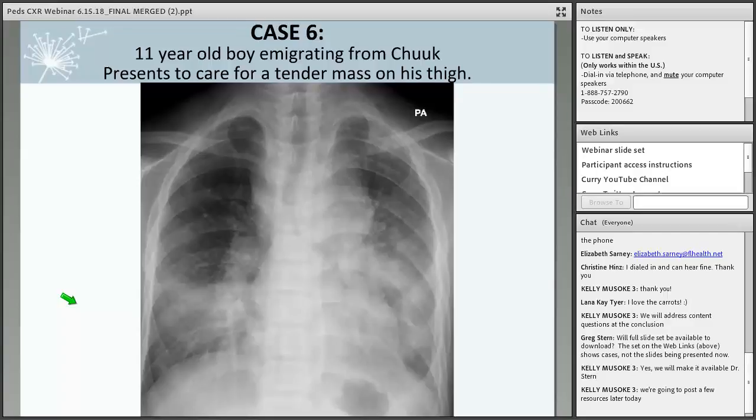When you look at the history of diagnosis of pediatric TB in the United States, our diagnosis is really based on plain film radiograph. Essentially all children who have a TB infection early on are going to have some enlarged lymph nodes, and if we obtain CT scans on what's otherwise a normal chest radiograph, we may overdiagnose those findings.